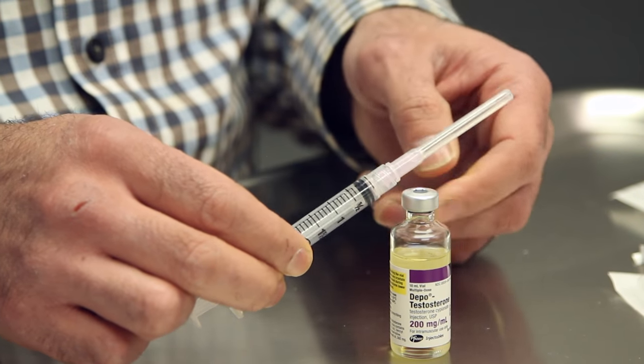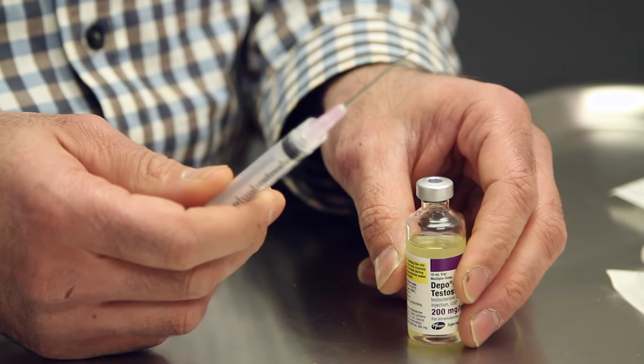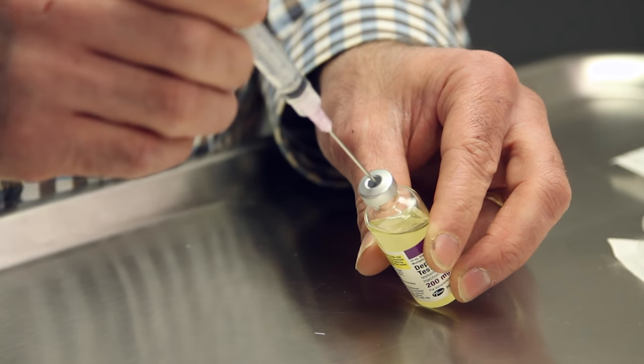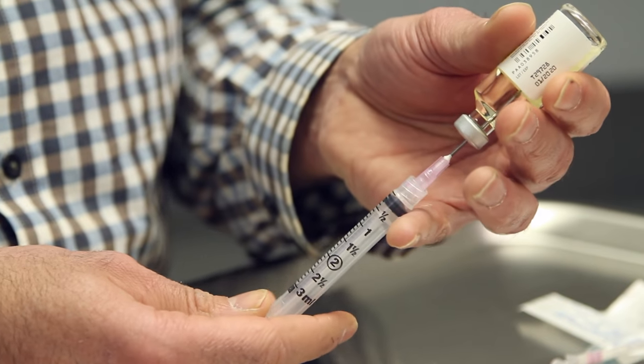If it hasn't, you will have to put the needle onto the syringe. Remove the top to reveal the actual needle, then put the needle inside the rubber stopper and flip the bottle over.